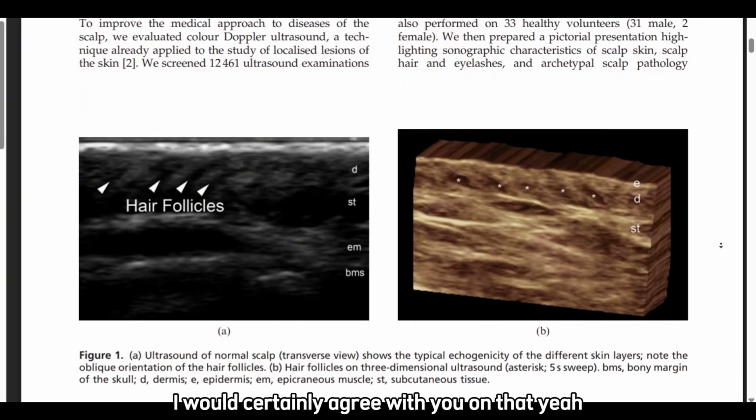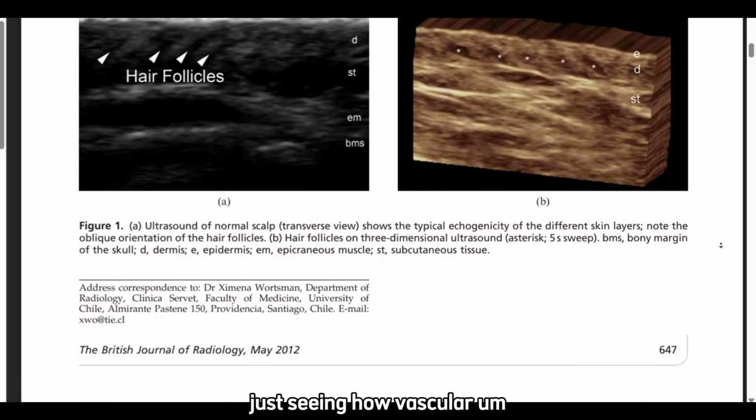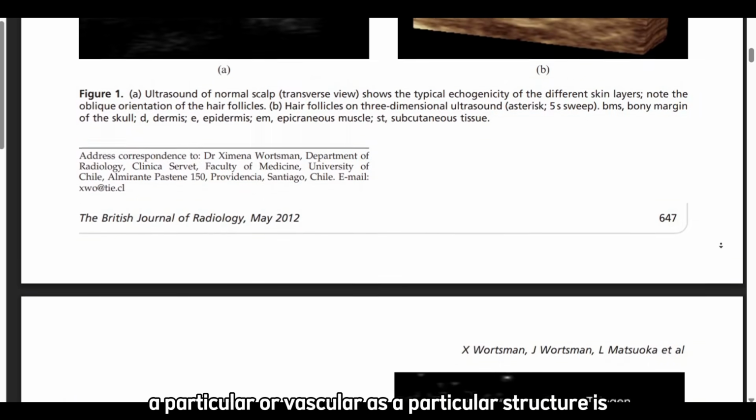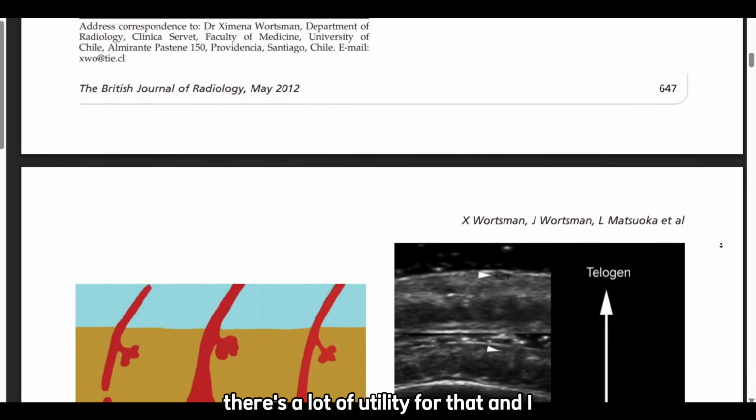I would certainly agree with you on that. Just seeing how vascularized a particular structure is, especially with something like a tumor, there's a lot of utility for that.